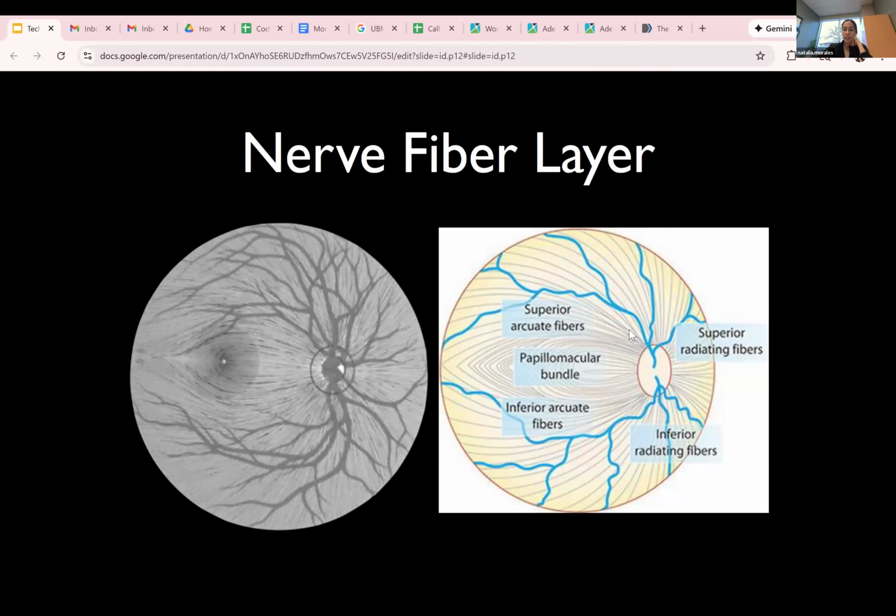The reason that's important is glaucoma visual fields usually will respect the horizontal meridian. They can blend, but often if you have a nasal step defect, which I'll show you in a couple of slides, it really does respect that horizontal meridian, like I mentioned. That's because it's typically death of a nerve fiber bundle. As that goes away, the death of that bundle will match a visual field change, but it'll be opposite, because of how we detect information and then flip it when our brain is processing it.